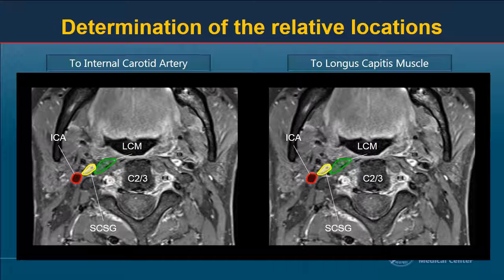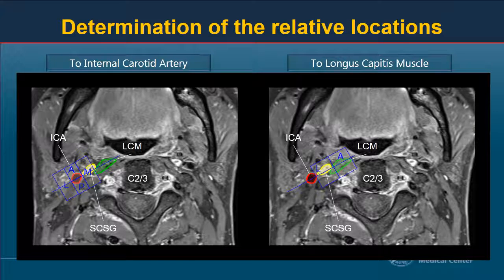This shows contrast-enhanced fat-saturated T1-weighted images obtained at the level of C2 and C3 intervertebral disc. To describe relative location to the ICA and longus capitis muscle, we used a parallel line to the long axis of the ganglia and two vertical lines at the lateral and medial margin of the ICA, plus another parallel line and one vertical line at the lateral one-third of the longus capitis muscle. The typical location is medial to the ICA and lateral to the longus capitis muscle. Possible anatomic variations are anterior, lateral, or posterior to the ICA and anterior to the longus capitis muscle.